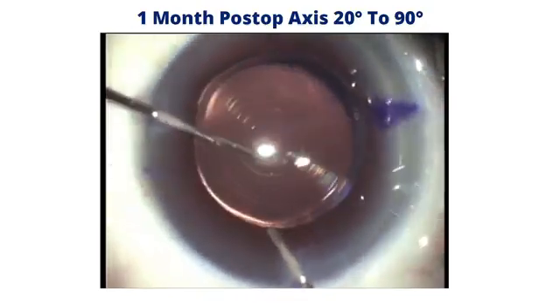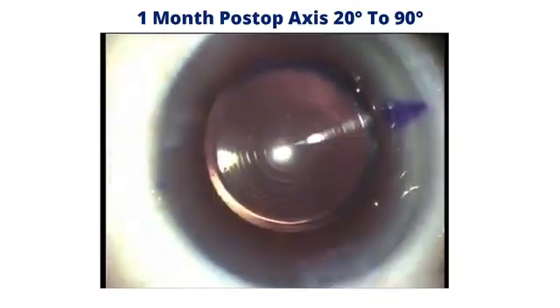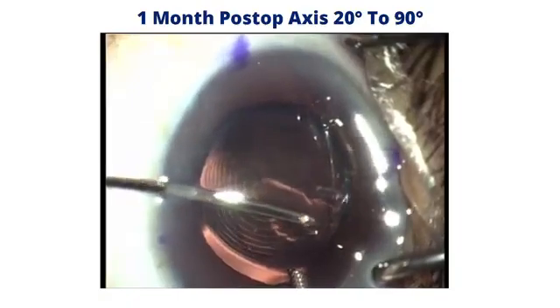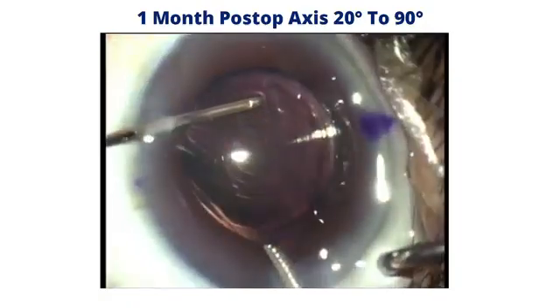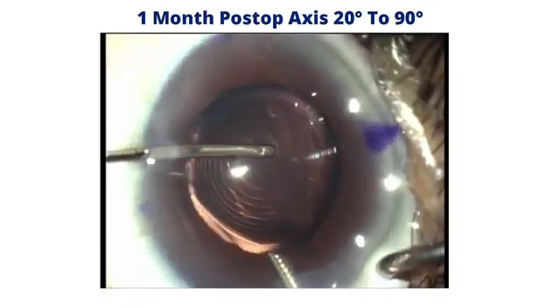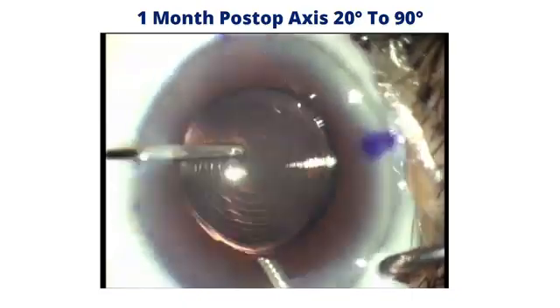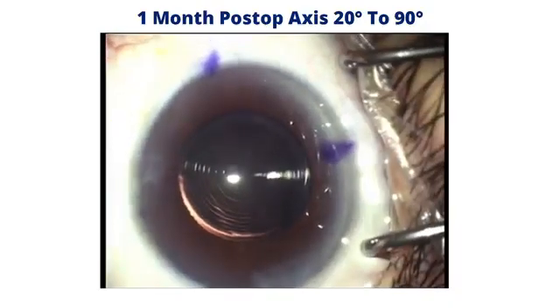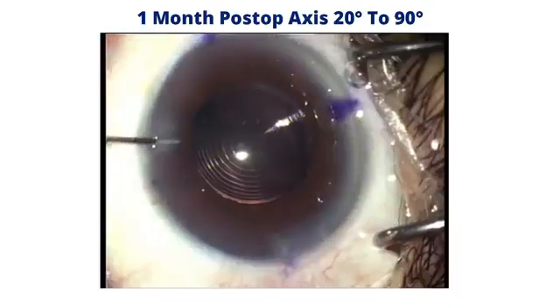And in this case, because the lens was not really that adherent to the posterior capsule, I hardly had to put any viscoelastic into the bag behind the intraocular lens. So it's important to remove the viscoelastic completely, and I'm trying to still keep to the small paracenteses, and that is why I've done a bimanual kind of aspiration of the viscoelastic.